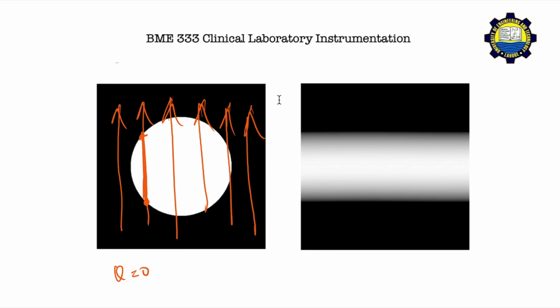So there's obviously some magnitude. And then I have ones here, and when I sum all the values in this column, it's going to be higher than this. Similarly, when I do it along this column, I'm going to have a projection value about here, and then here, and then nothing again. So essentially my profile is going to look something like this.